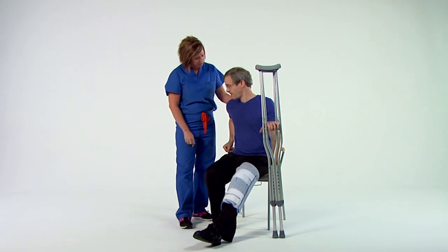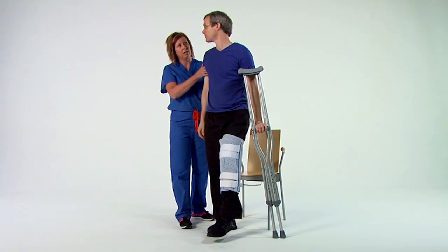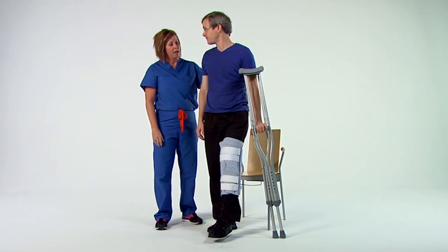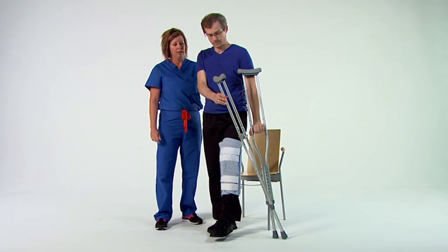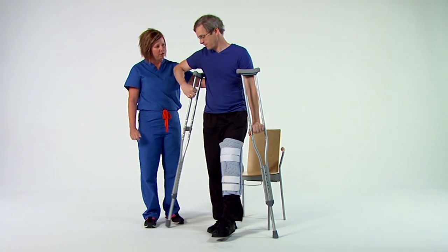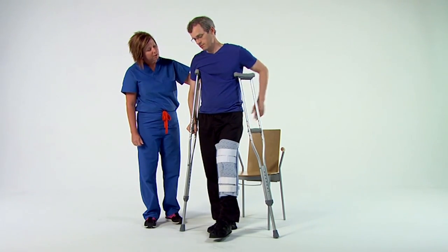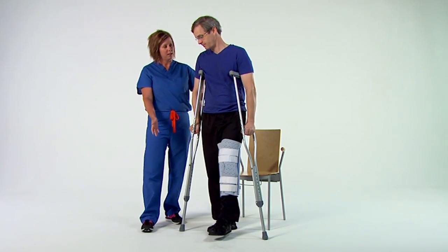With your non-surgical foot on the floor, push yourself into a standing position and transfer your weight onto the crutches to maintain your balance. Once you're in a standing position, slowly release your grip on the outer crutch. Using the opposite arm, grab the upper part of the crutch and place it under that arm. Use this to help yourself balance while you position the other crutch on your surgical side.